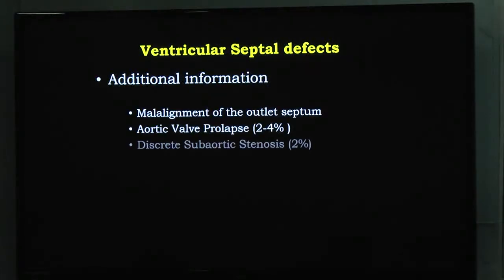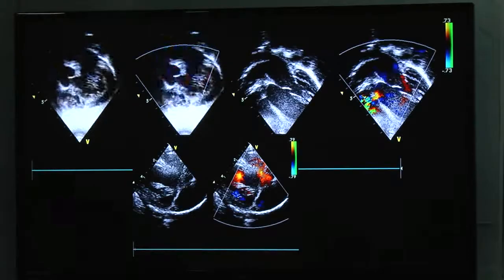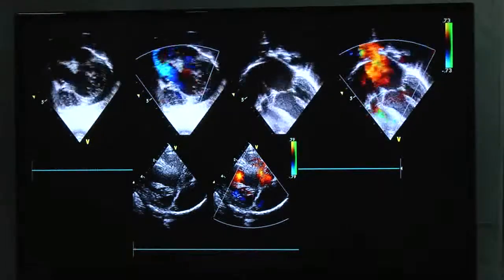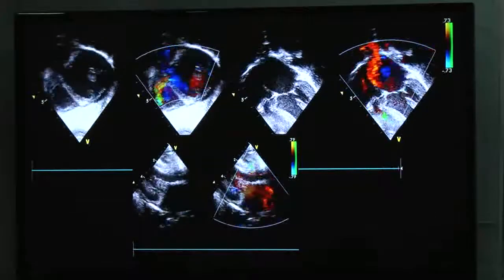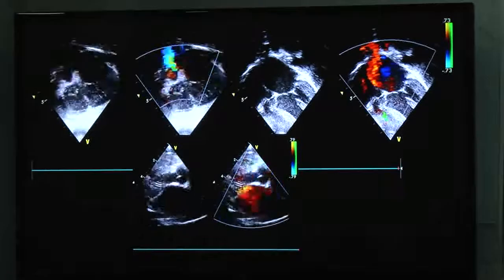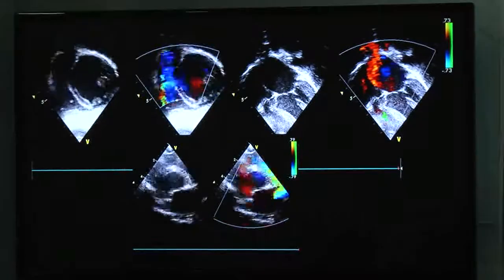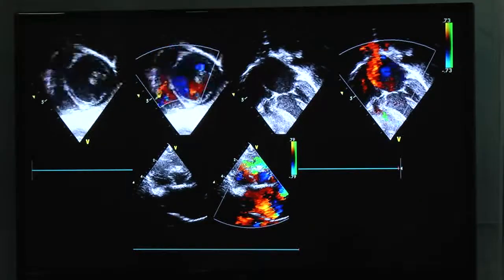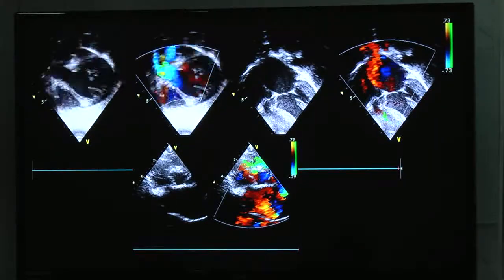So I'll just go to the TE pictures if I have. And this is what we look at during the transthoracic echo. We see the ventricular septal defect, and we see whether we see the defect at the level of the aortic valve. I know that it is slightly away from the aortic valve. So I look at all the VSDs and other things myself as well.